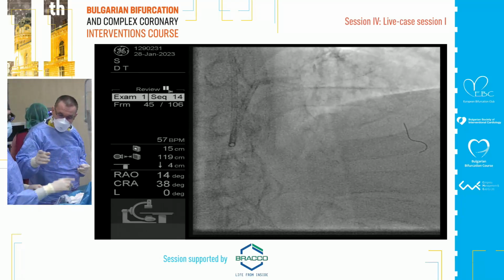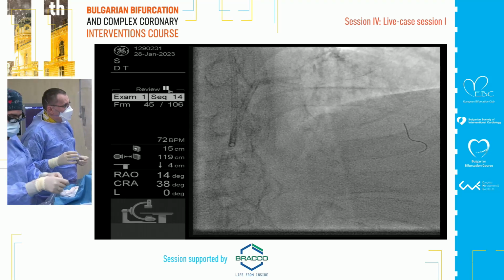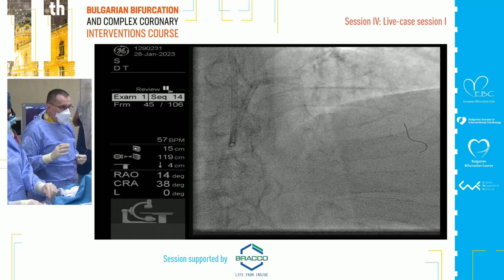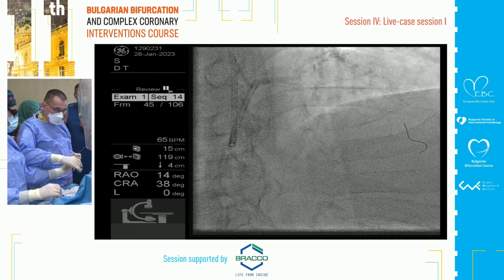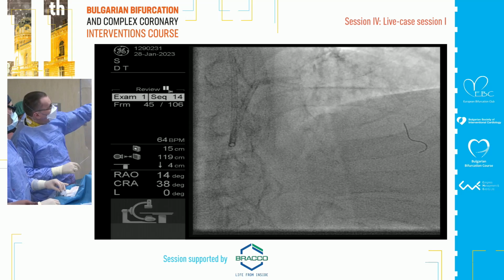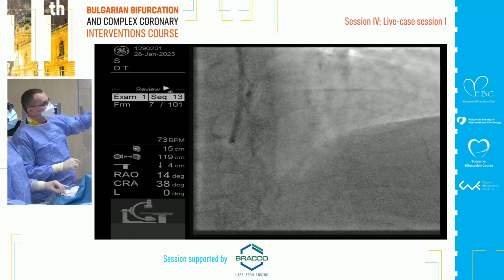Dobrin, why only short runs? Why not make one or two more runs with atherectomy? Or did you already do three or four runs? They do IVUS anyway. Don't worry. Because at the end of the polishing of the lesion, it was just for you to cross with IVUS.